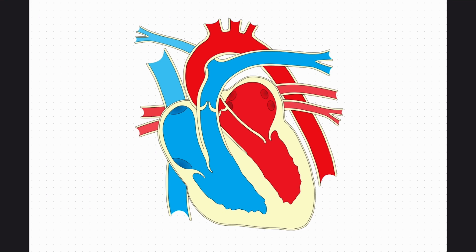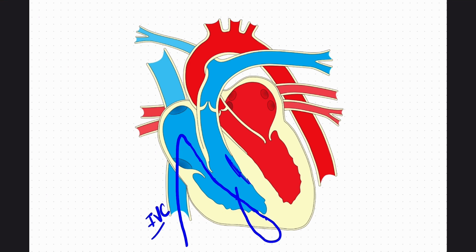It follows the direction of blood flow. This is the IVC. You enter through the IVC into the right atrium, the right auricle. Cut through the posterior tricuspid leaflet, and you enter into the right ventricle. Run 1 centimeter lateral and parallel to the posterior IVS as far as possible till the apex. For the outlet, you extend this incision onto the anterior surface, and this too runs parallel to the anterior interventricular septum. Cut through the anterior pulmonary cusp, enter the main pulmonary branch. That's it. This is the exit for the right side of the heart.